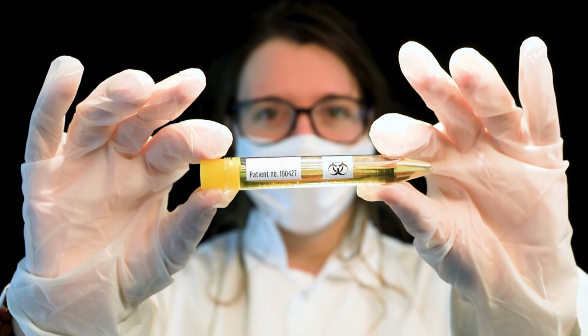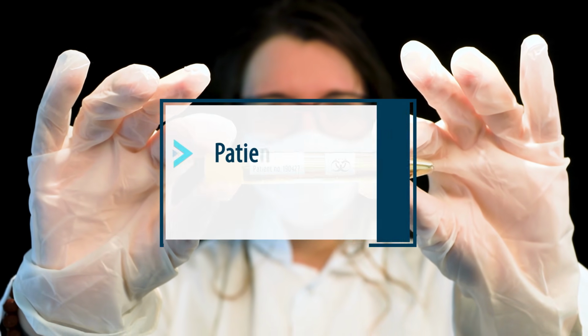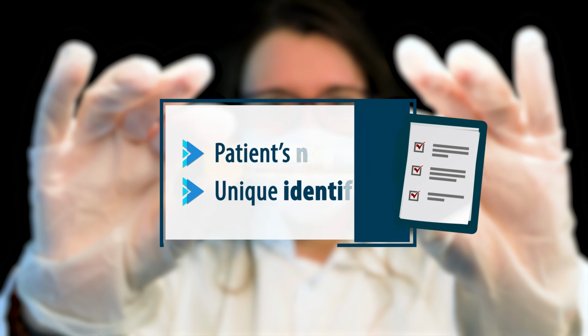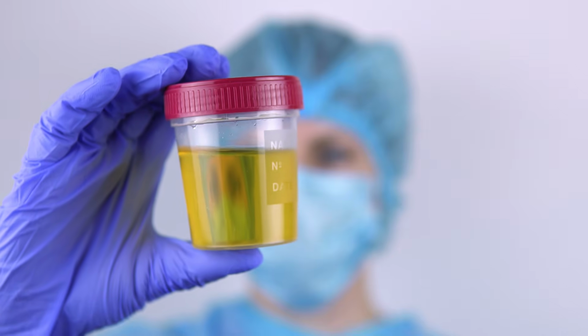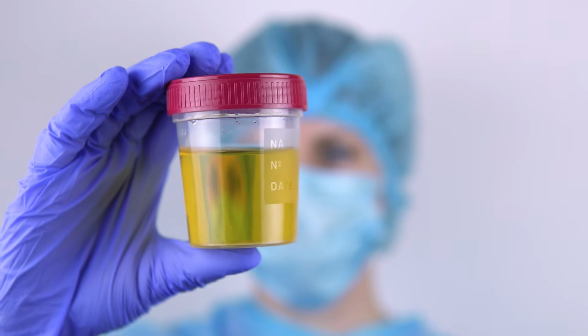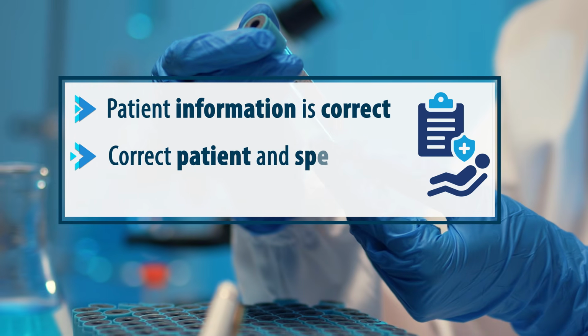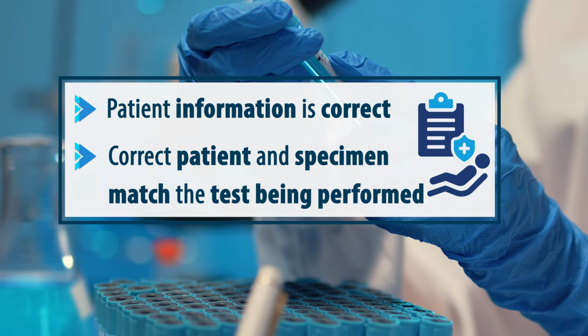Check the labels once more to verify that the patient's name and a unique patient identifier, such as the patient's date of birth, are listed. After you collect the specimen, you must ensure the patient information is correct and that the correct patient and specimen match the test being performed.